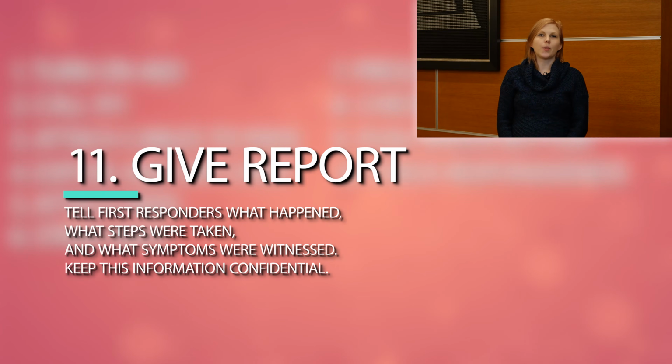Step number 11. When first responders arrive, they will require a report from the operator of the AED, indicating what happened, what steps were taken, and what symptoms were witnessed. This report is considered part of a patient's medical history and should be treated as confidential at all times.